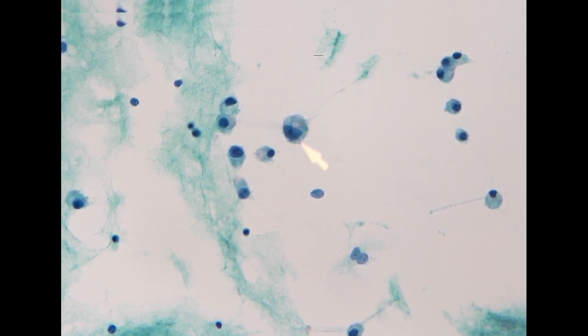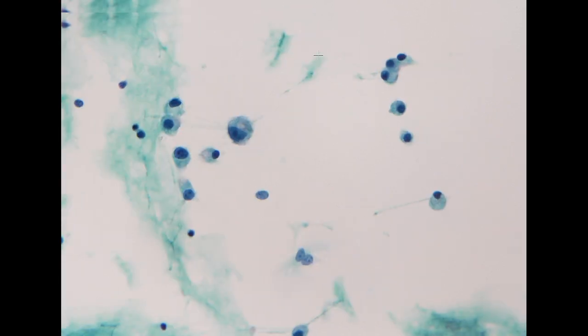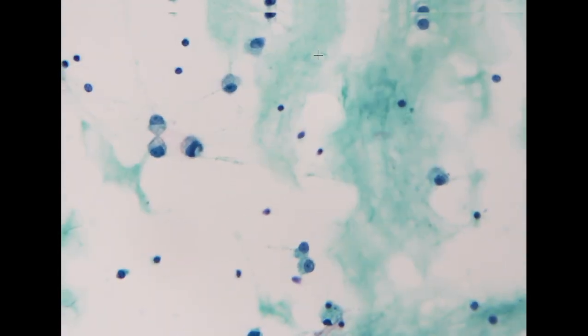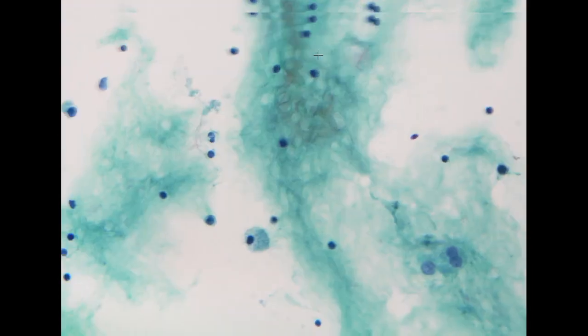So we have single cells with an eccentric nuclear feature, relatively similar to signet ring cells. And in the cytoplasm, we do identify some of the amphophilic material, pushing the nucleus to one side of the cells.